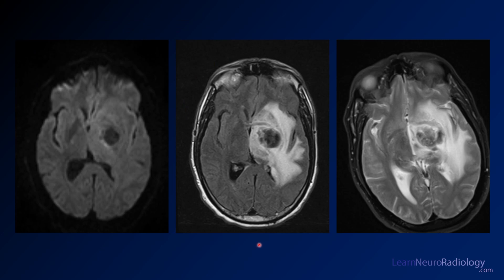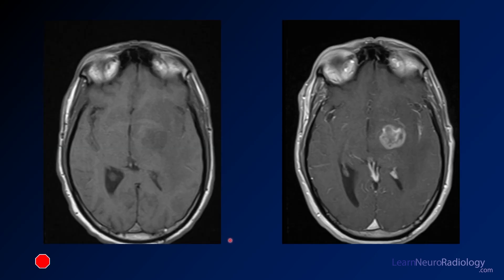We've got some images from an MR of the same patient — diffusion, FLAIR, T2 — to try to characterize that lesion and what's going on. Here we have pre- and post-contrast through this region. Here's your pre-contrast, here's your post-contrast. Looks like it's enhancing.